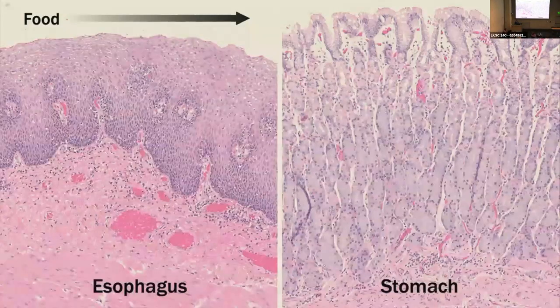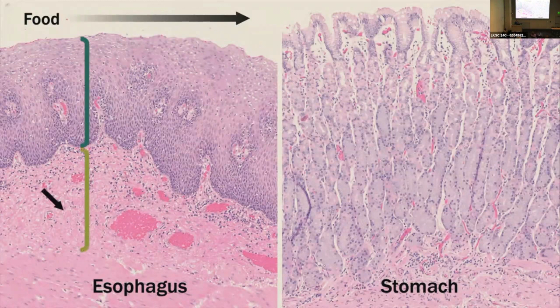All right. So let's look at the GI tract. The esophagus is mainly just a tube that goes to your stomach. On the top layer, you have this epithelium or surface covering. And as the cells mature from bottom to top, they become larger and more dispersed. Beneath that, you have these noodly extracellular collagen fibers. And you also have these kind of dark pebbles without much cytoplasm. These are lymphocytes. And then again, we have these non-nucleated bright pink cells within tubes, which are red cells within vessels. And then below that, you have a smooth muscle layer.